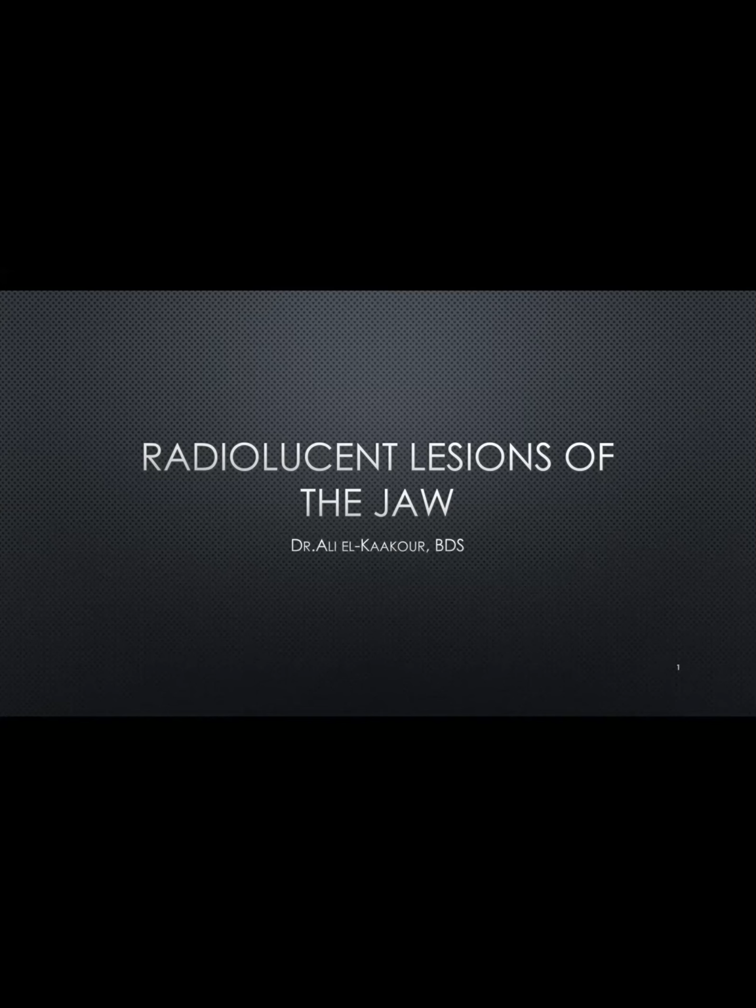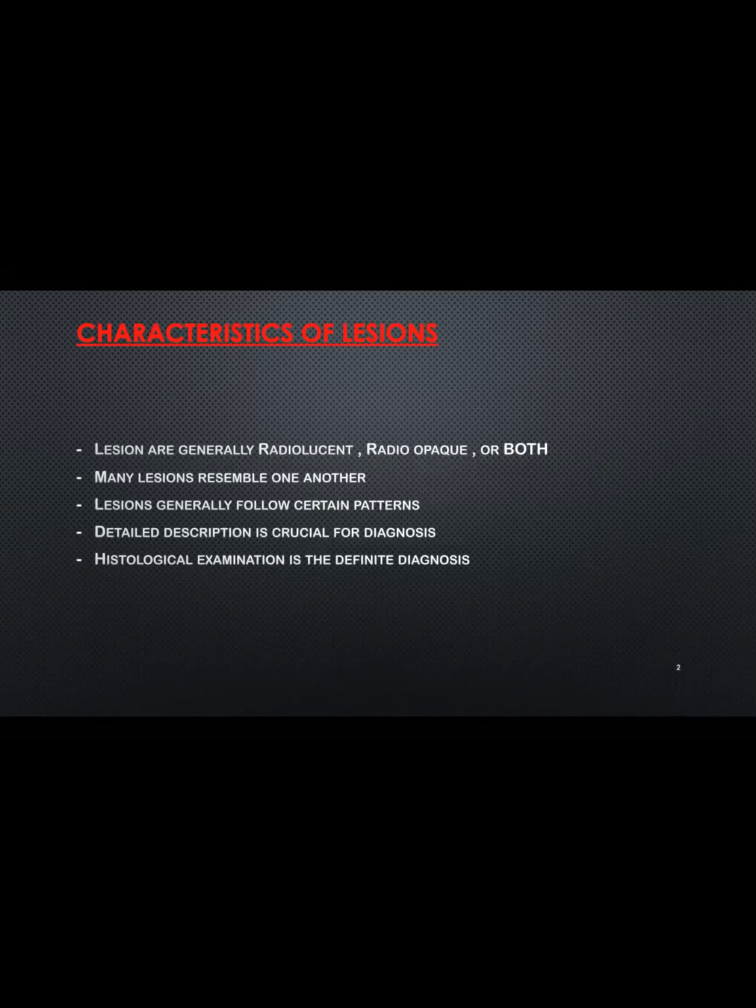Radiolucent lesions of the jaw today. Okay, so before we start discussing radiolucent lesions, there's a few points that we have to be aware of. First of all, almost all conditions are either radiolucent or radio-opaque, and some of them are both at different stages of their development.